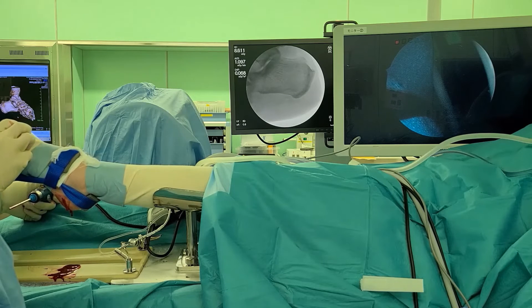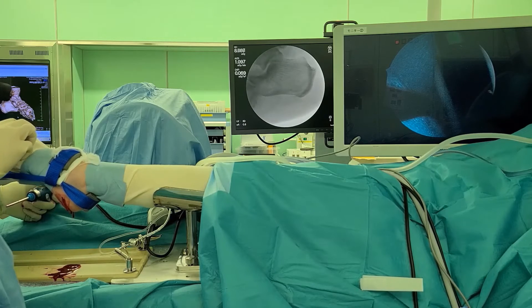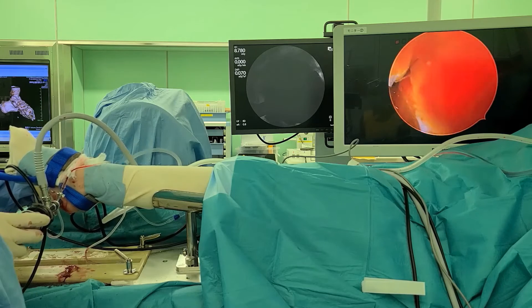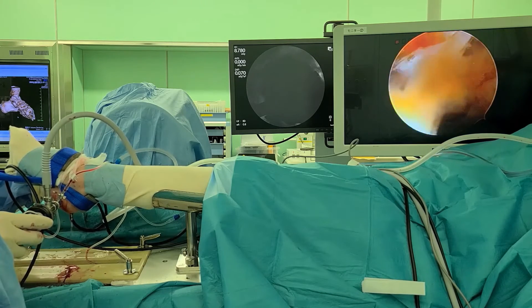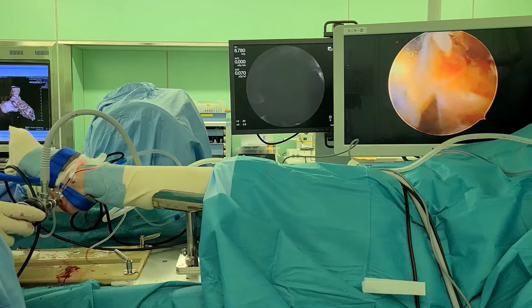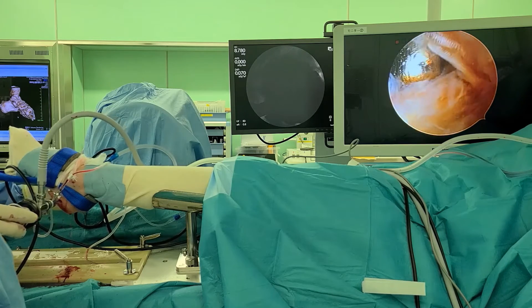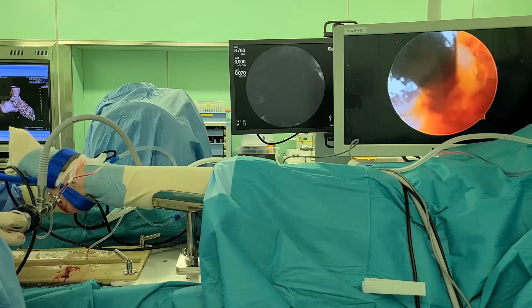The spur resected space became the working space for endoscopy. An arthroscope was introduced through the lateral portal and advanced on the plantar fascia to reach the spur resected space. A cutter was introduced through the medial portal and advanced to the arthroscopic view, and the debris was cleared.